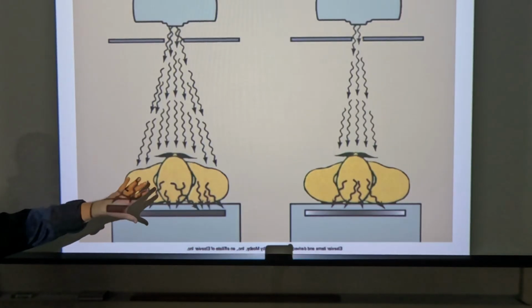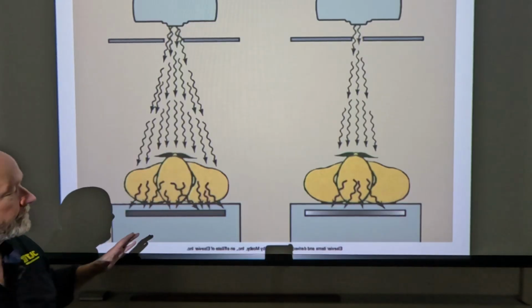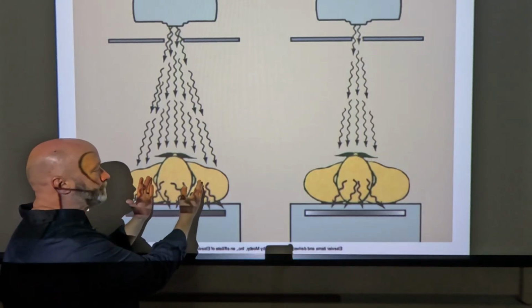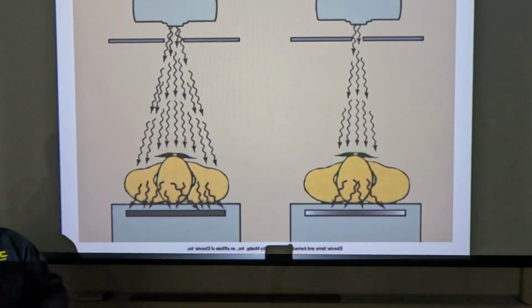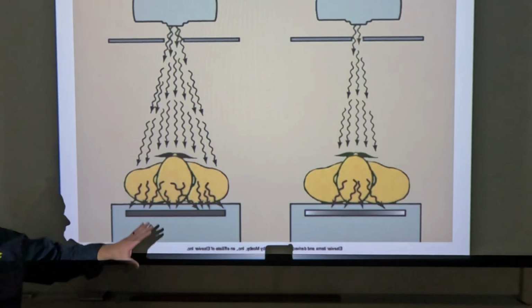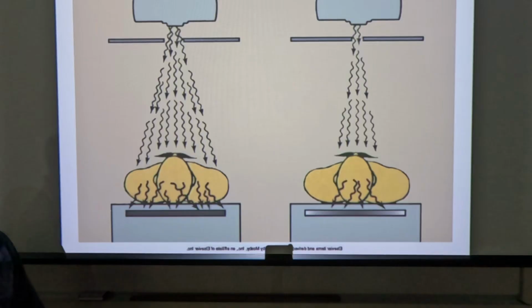so let's say on this image we shot this image and we got the perfect index number. Let's say the range was 200 to 400 for a valid index number. You hit right on 300, right in the dead square middle of it on this image. And the radiologist said, okay, and let's say this is portable or something where you had to set a technique.